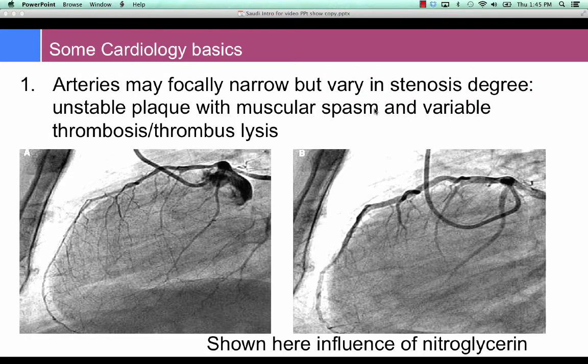And here's an example of how nitroglycerin can affect the size of the coronary vessels. For example, it's been given to a person; the angiogram on the left is pre-nitroglycerin, the angiogram on the right is post-nitroglycerin, and you can all see that the arteries are much larger. We almost uniformly give everyone nitroglycerin, holding it back in case the blood pressure is particularly low or if patients have taken erectile dysfunction medication recently. But typically nitroglycerin makes the arteries bigger, and you can easily see the dramatic response of coronary arteries to nitro here, and why we like to use it to enhance the size of the vessels for CTA imaging.